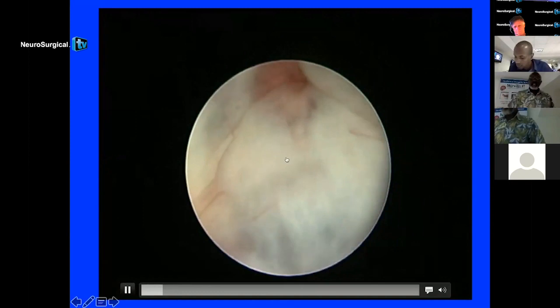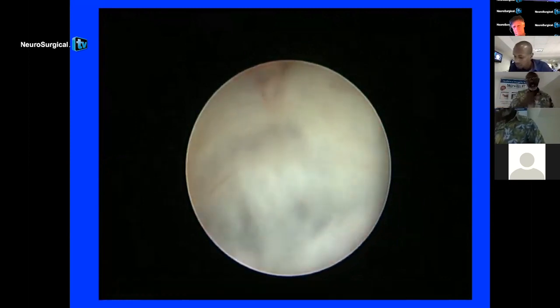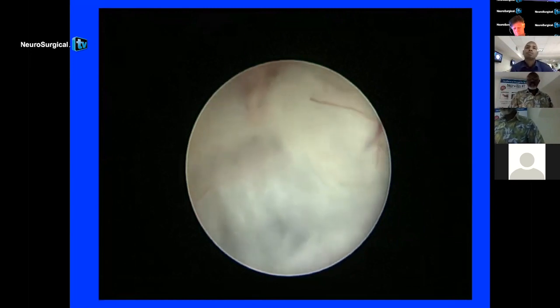Now, the technique that was shown earlier, straight down, holding it next to your body, the free-handed technique is what we utilize. And for the patient's head, we sometimes just secure it using simple 3M tape, so that the head does not move around much.